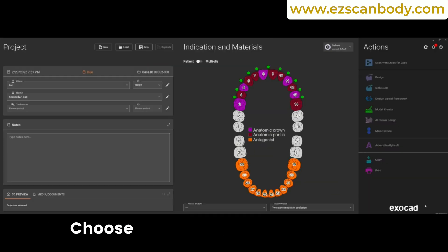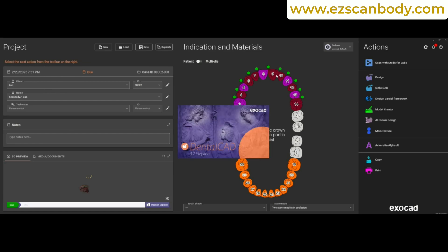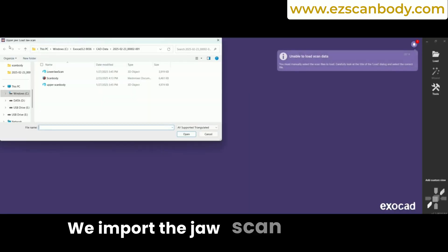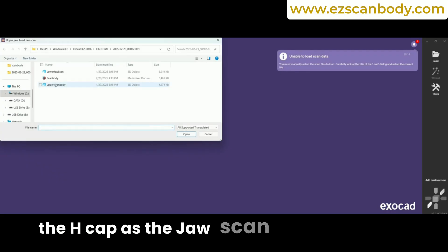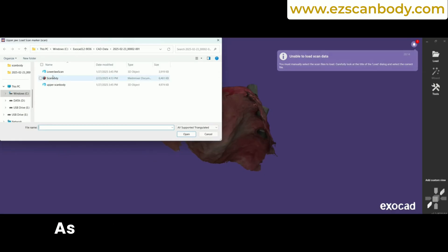For the Pontic, choose an anatomic Pontic with the Thimble option and Virtual Gengiva. We import the jaw scan with the H-CAP as the jaw scan, and then import the H-CAP scanned with the photogrammetry camera as scan markers.